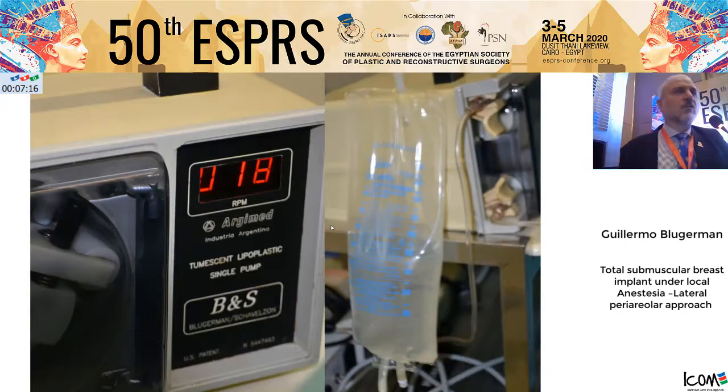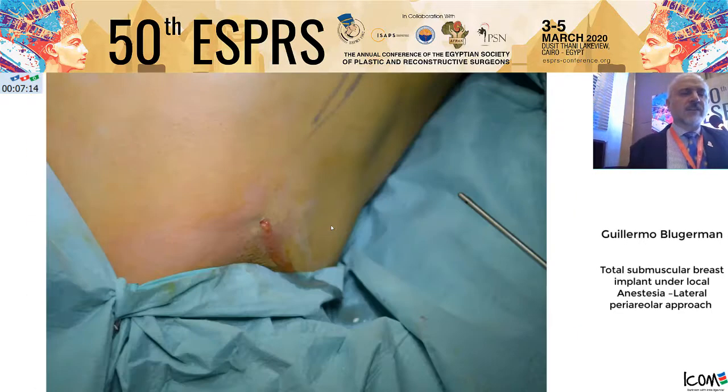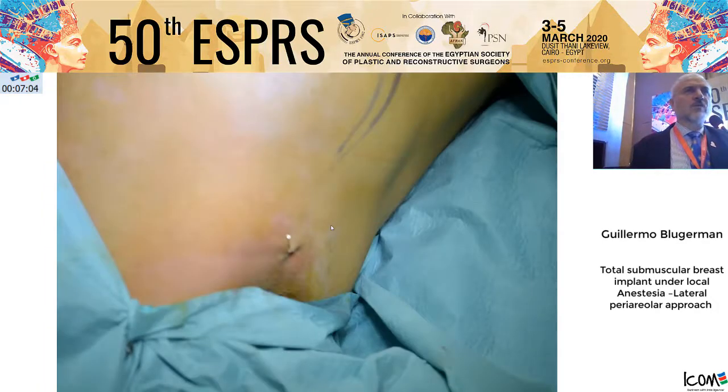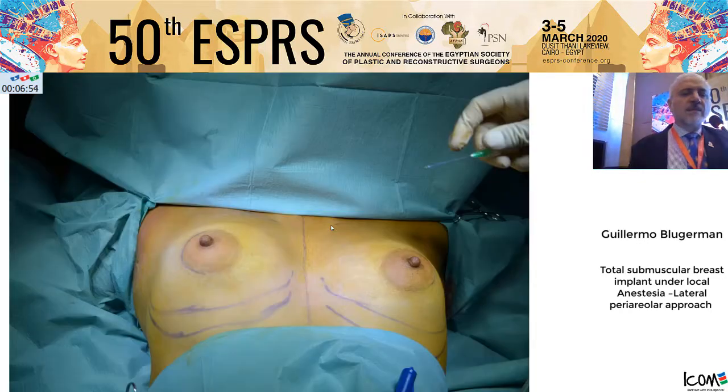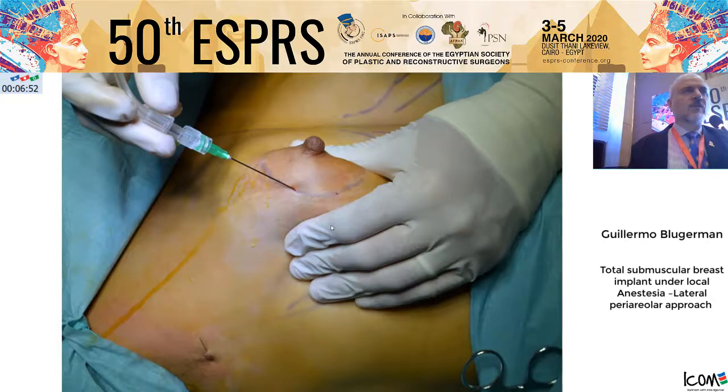We infiltrate regularly 400 ml below each pectoralis. This allows us to create the space for the implant. To avoid exit of the solution, because it is under pressure below the pectoralis, we close just with the needle. The idea is to produce a pocket below the pectoralis, the anterior serratus, and the rectus abdominis.